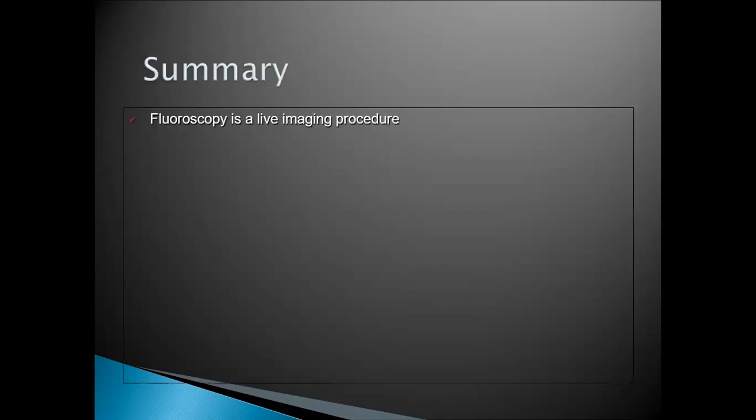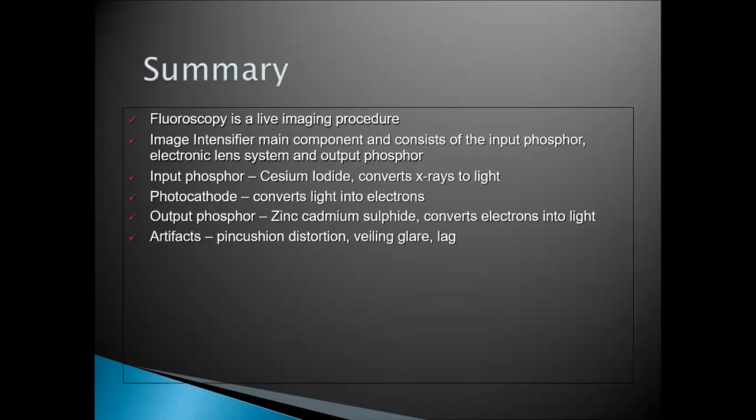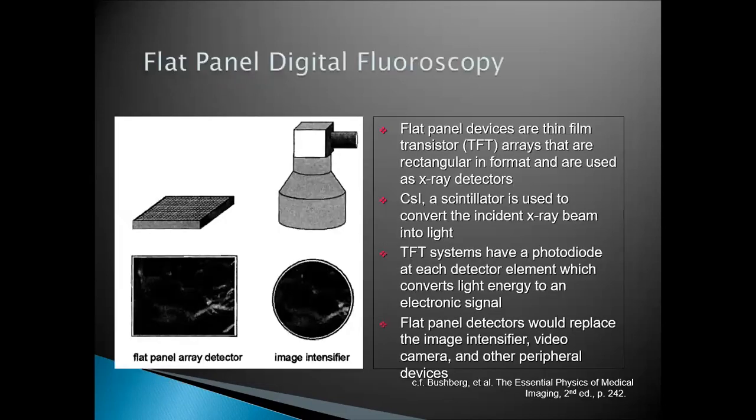That's because then, to summarize the first section. Today we are going to look at the second section, which starts with the flat panel digital fluoroscopy.